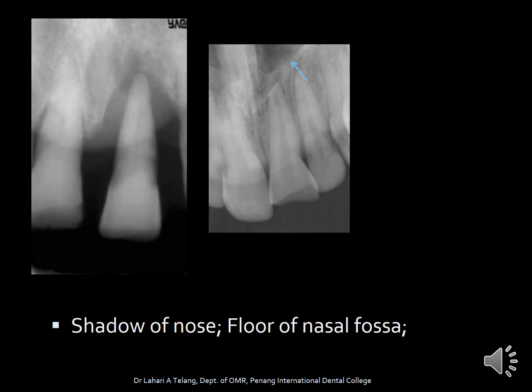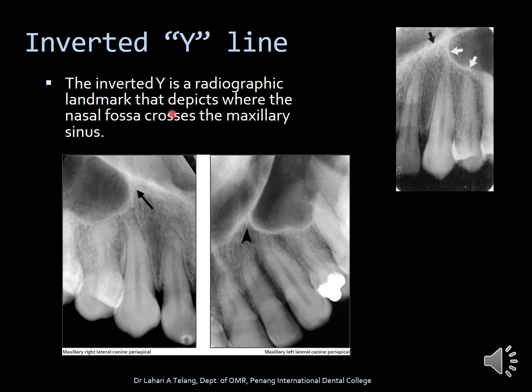This radiograph shows the shadow of the nose and also the floor of the nasal cavity. Interestingly, you can also see the inverted Y line — a radiographic landmark that depicts where the nasal fossa crosses the maxillary sinus. The nasal fossa and the floor of the maxillary sinus cross here, giving the appearance of an inverted Y line.